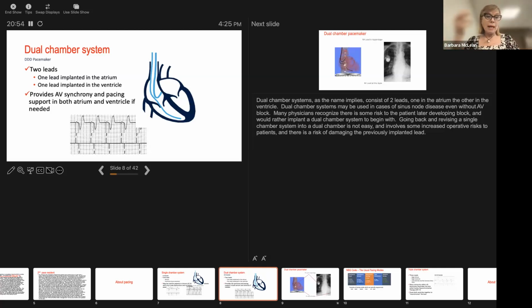And the last time I did it, which was last week, in a CTS patient, their stroke volume went up by about 12 cc's and their cardiac output increased by 0.5 liter. So really, really important for us to appreciate that. But remember, this patient has a permanent pacemaker. We can't manipulate that. EP has to manipulate it. Evaluation is going to be done with a magnet, but manipulation is going to have to be done in the EP lab.